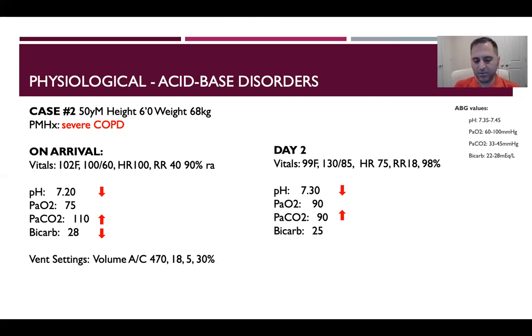But let's say this patient was post-operative, a COPD patient who needed a new hip, went to the operating room, and the anesthesiologist didn't feel safe for extubation post-op, so he ends up getting transferred to the ICU on the ventilator. Now on day 2, you're exactly right. You're looking at them and there's no real reason for me to be worried about this patient anymore. Whatever was happening, it looks like it's resolved. Now my main concern is the pulse ox is 98. Is this actually helping this chronic COPD patient, or is it taking away the respiratory drive? So that's an excellent point.